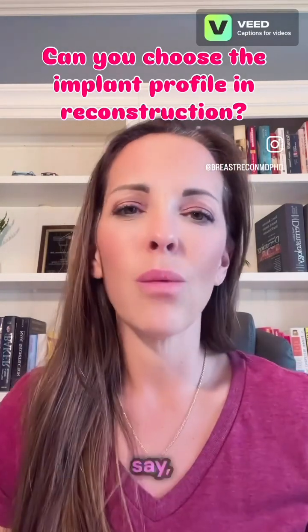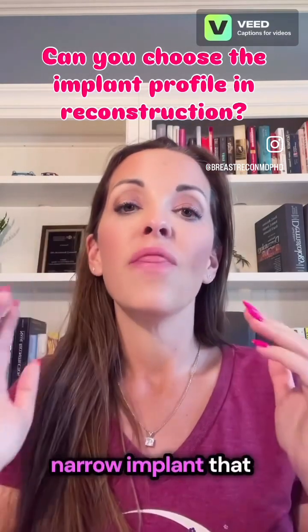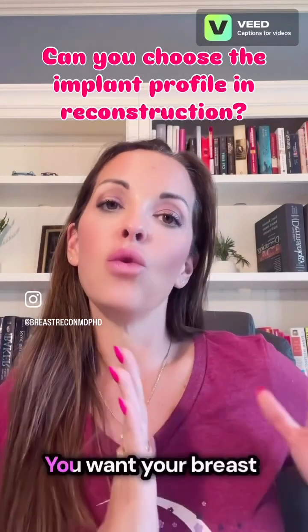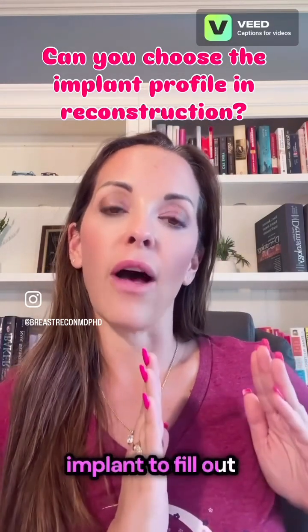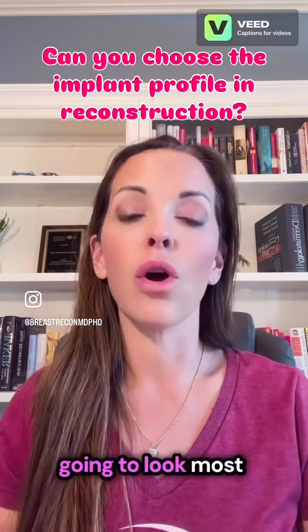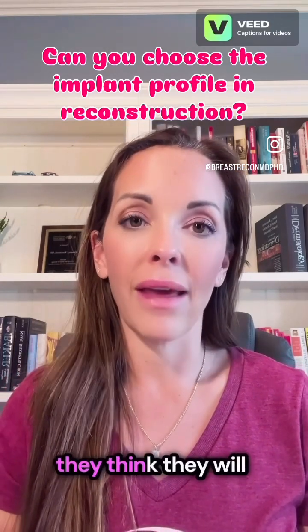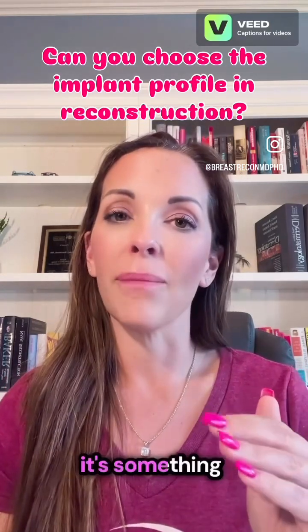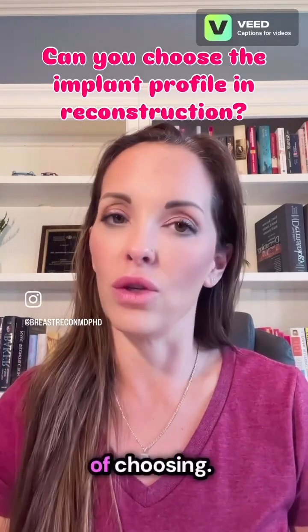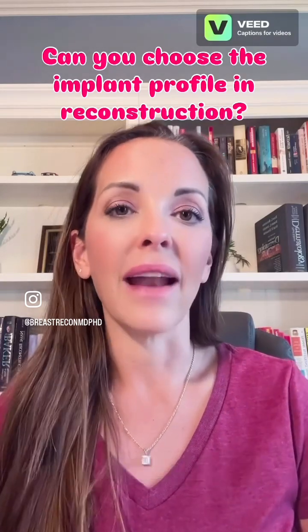Now patients will say, well, can't you just use a more projecting implant and a more narrow implant? That would make your breast look like you have a little softball on your chest. You want your breast implant to fill out the whole width of where your breast was because that's going to look most natural. Now you can ask your surgeon what profile they think they will be using, but remember, it's something that's really given to us as opposed to us having flexibility of choosing. This is very different than a primary breast aug. We can discuss that in a different video.